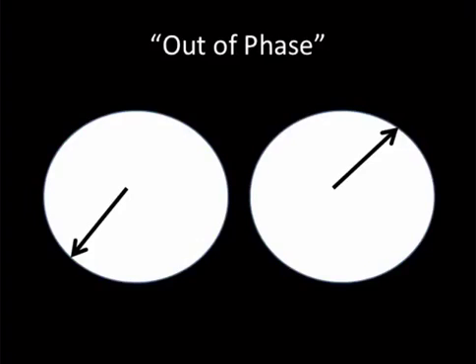Alright, so all that's great, but how do you actually produce a signal? When the transverse plane is coherent, or in phase, and perpendicular to the coil, this is when you have signal generation. It's sort of like running next to somebody who's running at the same speed. You can't measure how fast they're running. It's like an Einstein relativity thing. They have to turn and run away from you for you to measure that speed.